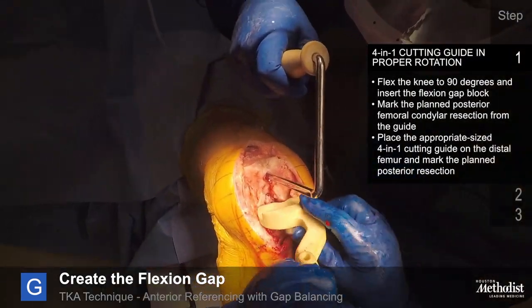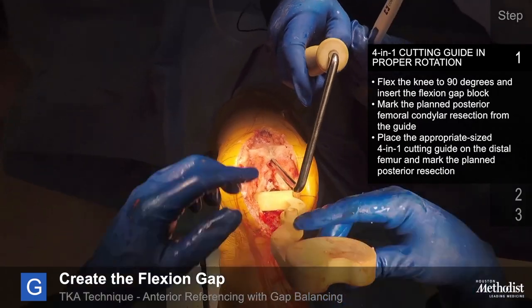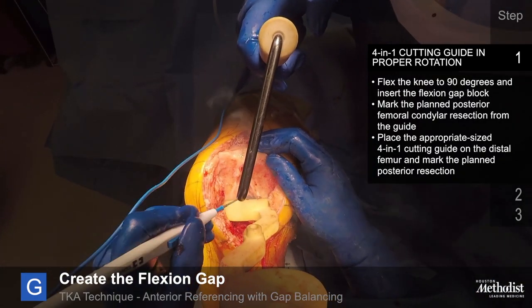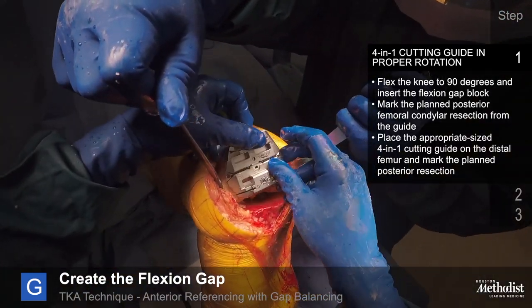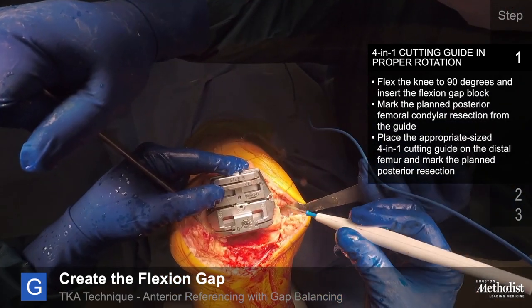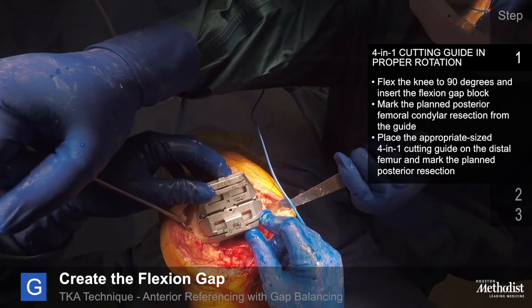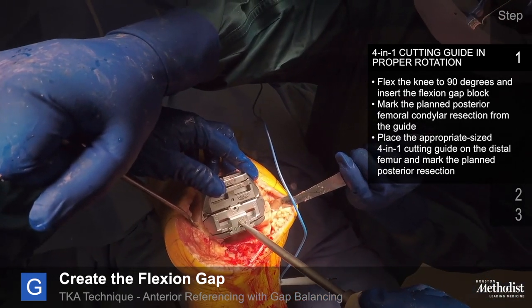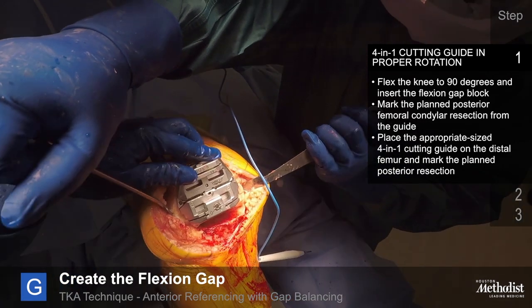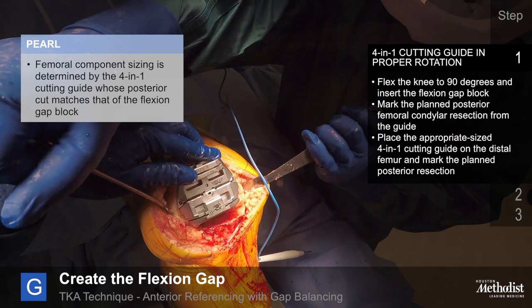Flex the knee to 90 degrees and insert the flexion gap block. Mark the planned posterior femoral condylar resection, then place the appropriate sized 4-in-1 cutting guide on the distal femur and mark the planned posterior resection line, comparing it to the line made previously with the spacer block. The femoral rotation has previously been determined by the anterior rotational cut on the femur; at this point, the anterior cut should be parallel to the tibial cut. Small corrections can easily be made to the femoral rotation by slight angular changes of the 4-in-1 cutting guide. Femoral component sizing is determined by the 4-in-1 cutting guide, and the posterior cut matches that of the flexion gap block.